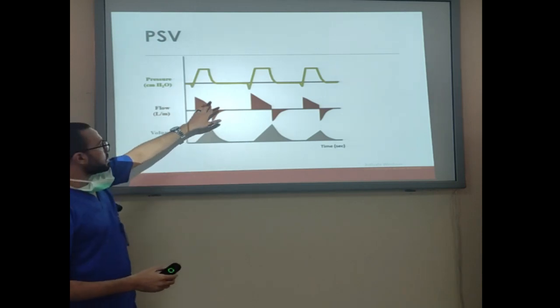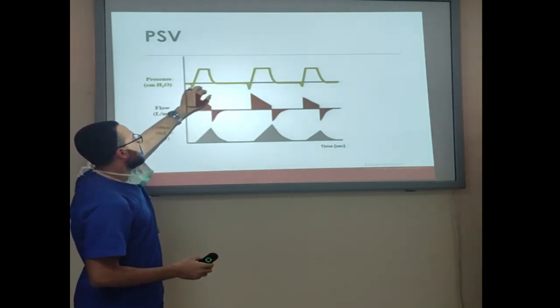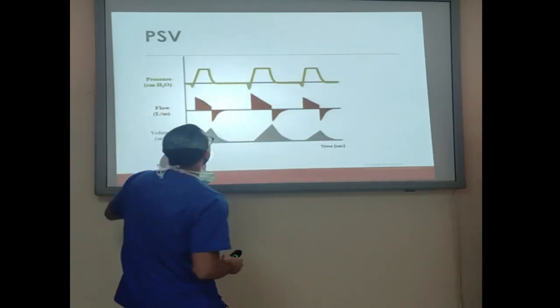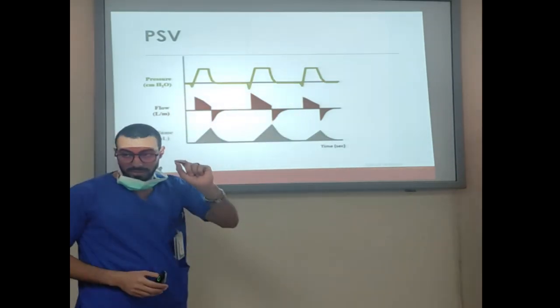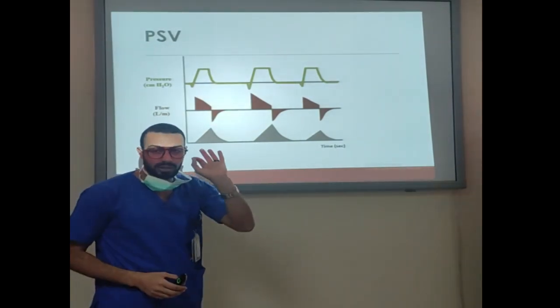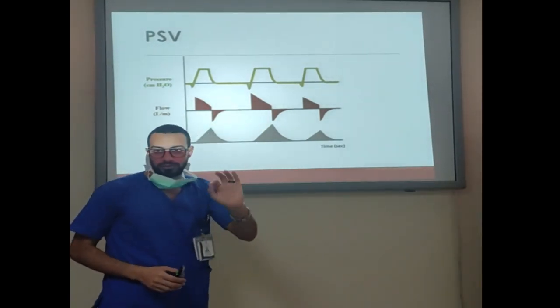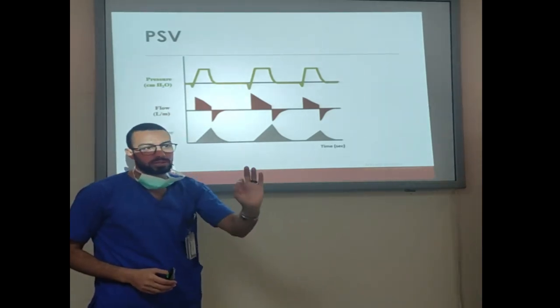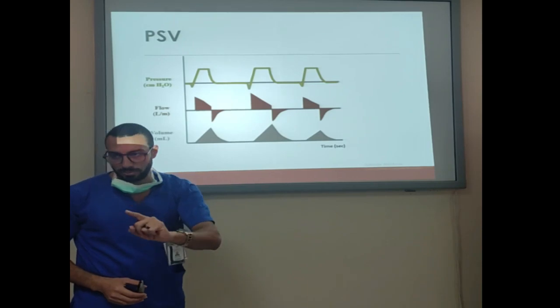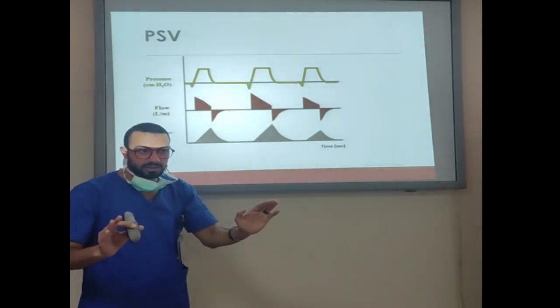So if you just notice this, we have here the same pressure. Okay? The same pressure. It's at the same point. So every time the ventilator will let the patient reach 25. If you put it 25, it will reach 25 every time. Either the patient takes it himself, or the ventilator supports. At the end, it will reach 25 centimeter water.